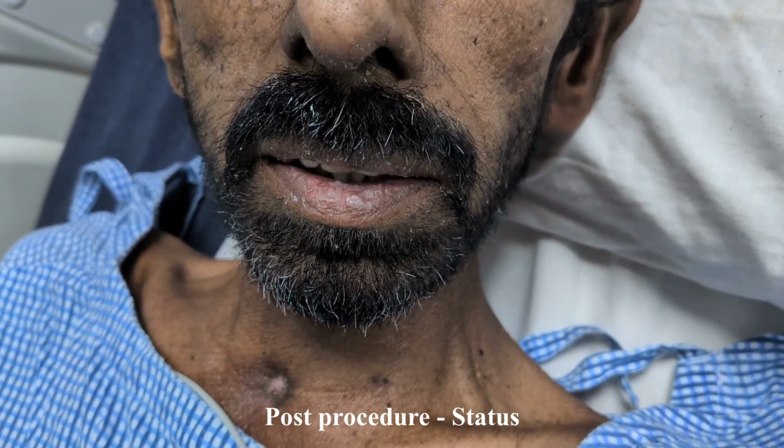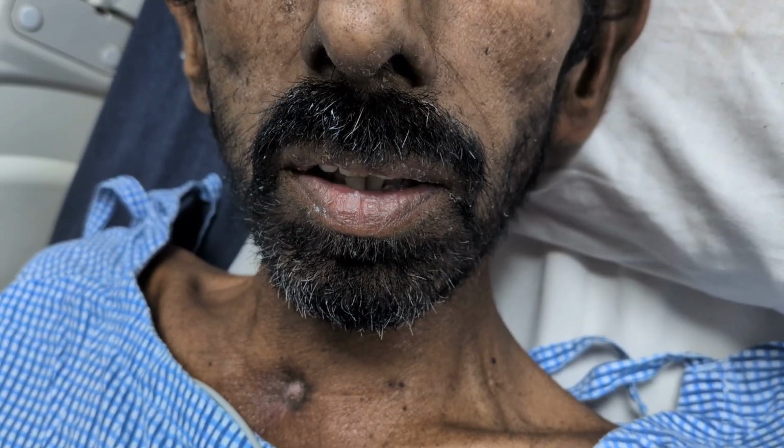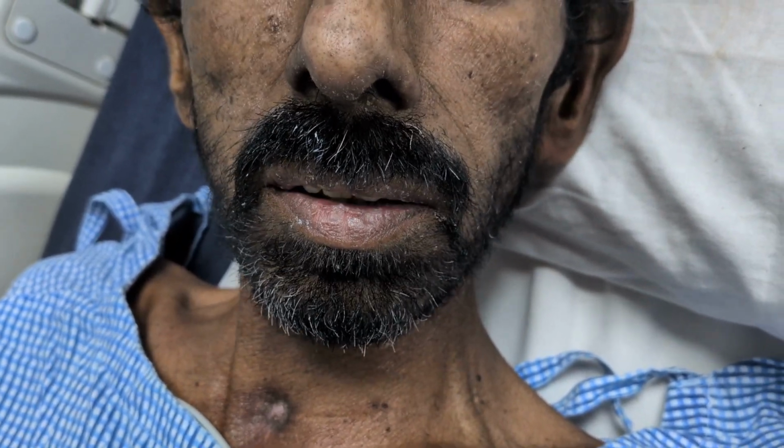And now you can see that post procedure, the patient has normal vocalization and he was mobile, and he was discharged in a walking state. So as palliative care improves, we may see more stents requiring such complex procedures of placing a stent in stent.